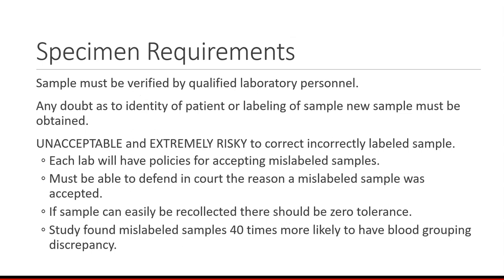Samples for the transfusion service must be verified by qualified laboratory personnel. So that would be me. That would be you, whoever is doing the pre-transfusion testing. If there is any doubt as to the identity of the patient or labeling of the sample, a new sample must be obtained. It's unacceptable and extremely risky to correct incorrectly labeled samples.